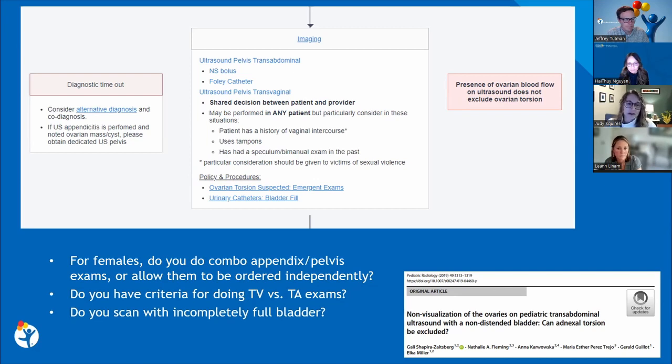Sometimes those patients are larger, and so the transabdominal imaging quality is worse. Sometimes we would be able to problem solve and not have those patients go on to MRI, which often needs at least a little bit of sedation, depending on the patient. So I also don't know exactly the right answer. I think teamwork and collaborative discussion is probably best.